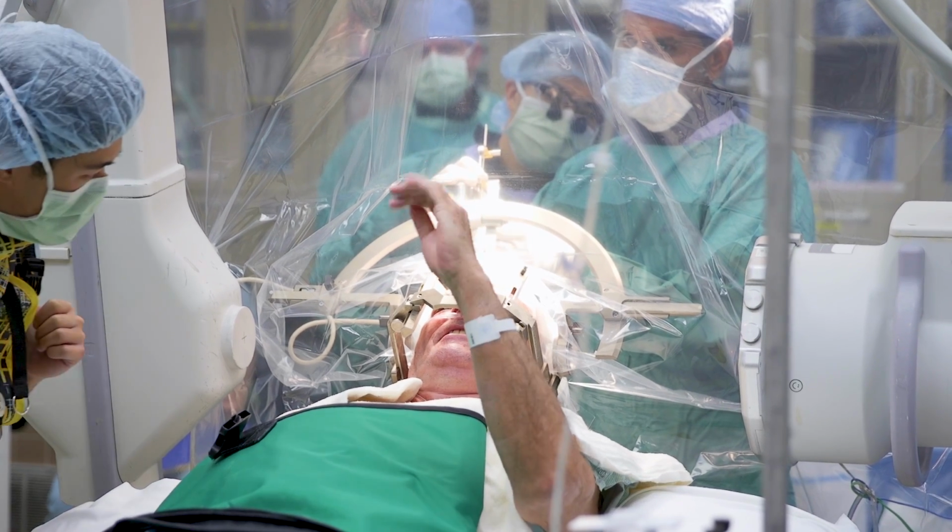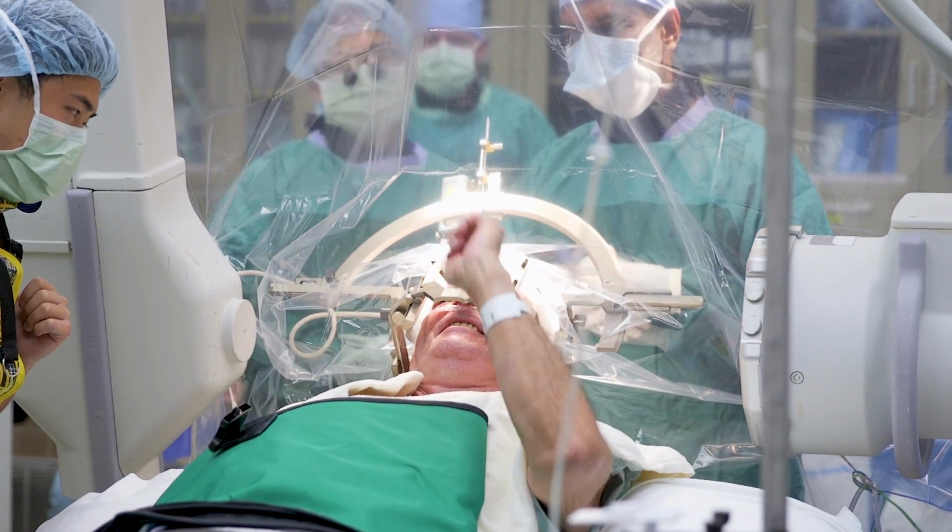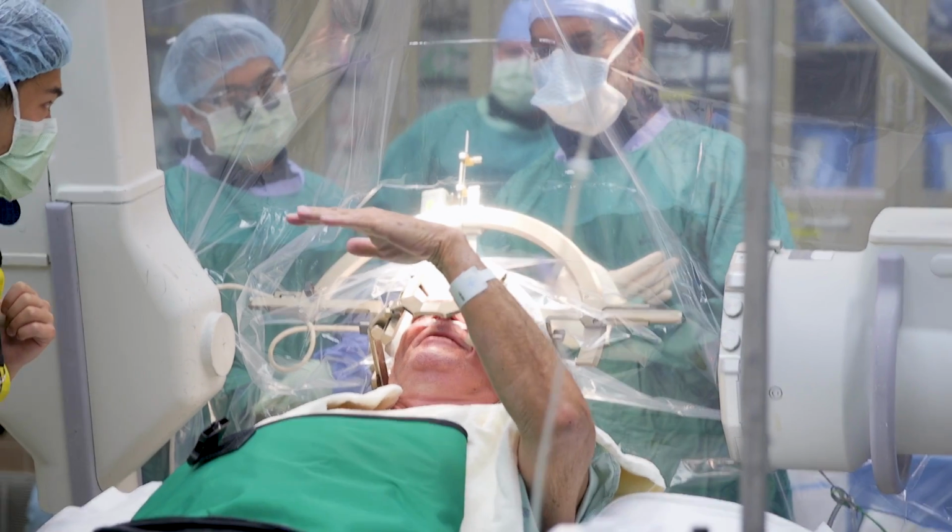Did you feel something in your hand? What did you feel? Like a shot. A little shot. That was the lead going in.